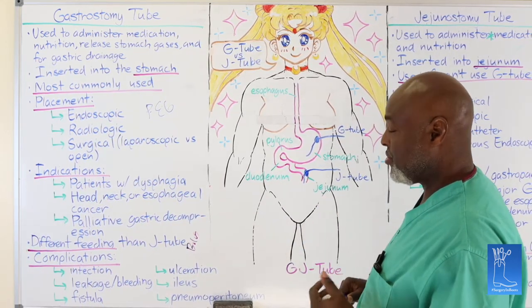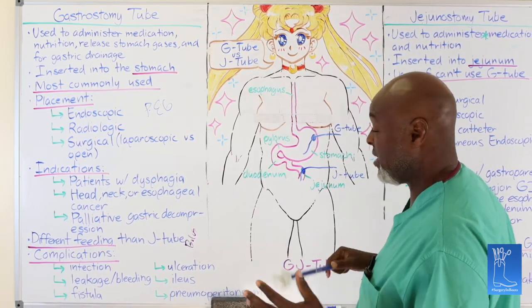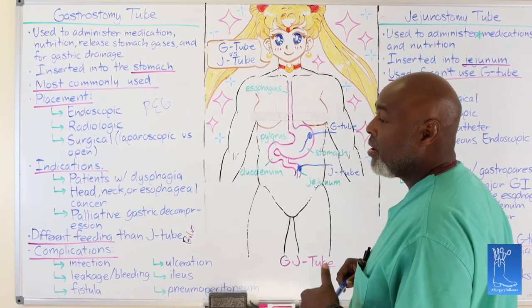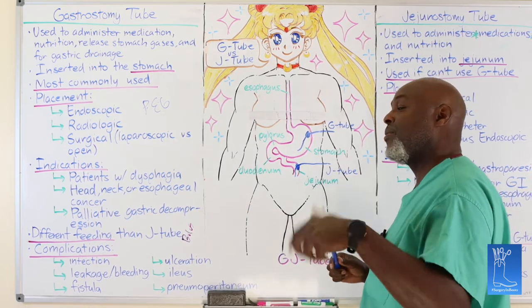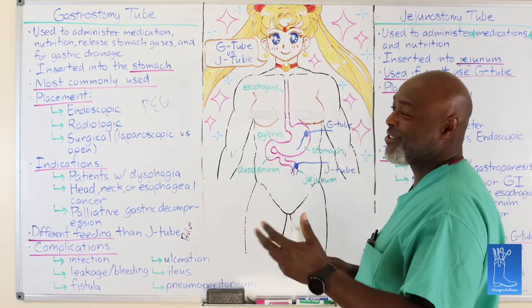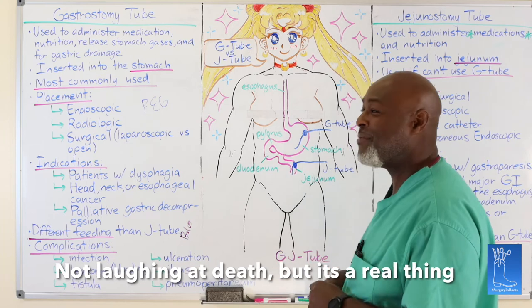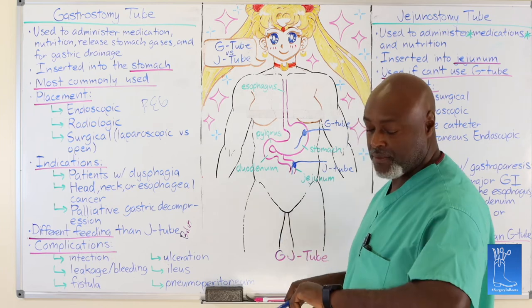You can also put medications through it, which is nice because you can crush the pills up, stick them in, and it works just as well. You can put whole pills in it if you want to. The G-tube is usually big enough that something like Synthroid, you wouldn't have to crush it up. Probably better if you do. Crushing up meds to put them in G-tubes is always a little complicated because you don't want an extended release pill. Like if you had extended release OxyContin and you crush it up and you put it in somebody's G-tube, they might pass out and die and stop breathing because they've gotten all of that narcotic at one time. So if you're crushing up pills, make sure you actually check.